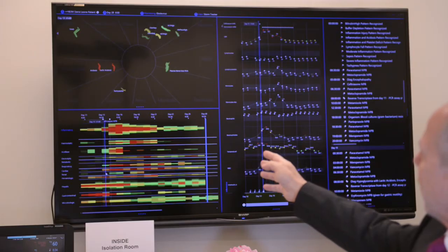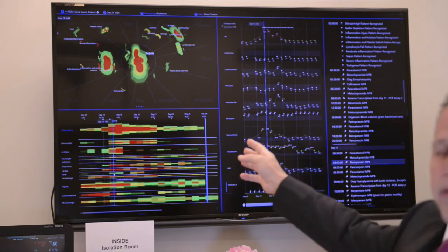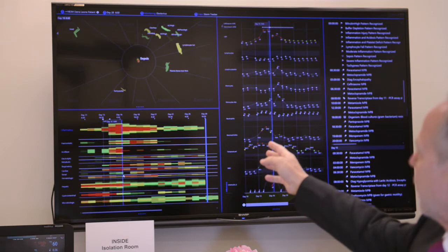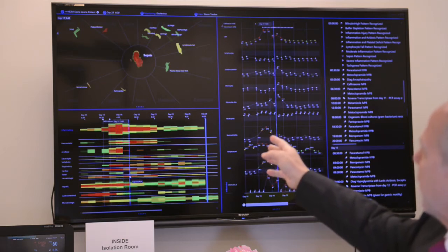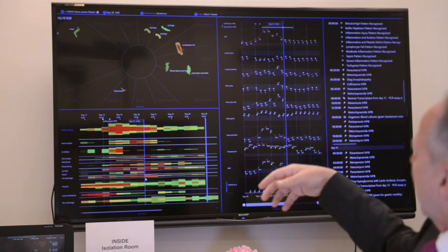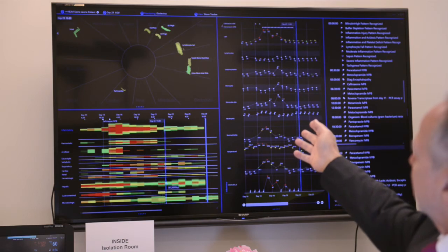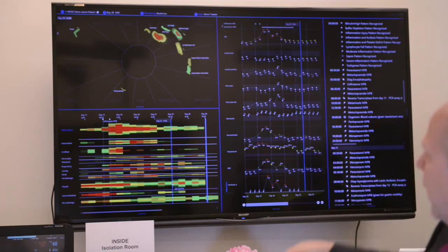So we developed technology which converts the data into a matrix and generates images which everybody can understand. For instance, we have the color radar weather image of the condition. We see that the patient begins, they have mild virus syndrome with changes in their liver and fever, and then it progresses over time as it evolves. Now the bacteria have penetrated the intestine to produce a sepsis picture. The sepsis evolves over time. The patient eventually recovers, and we see some residual virus in the urine and in the sweat.